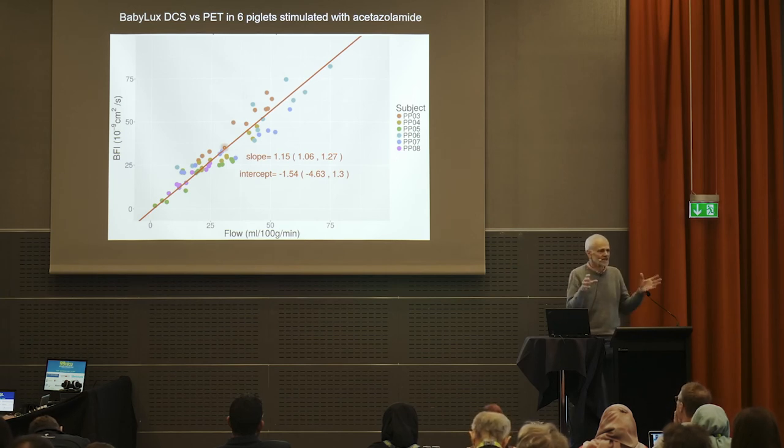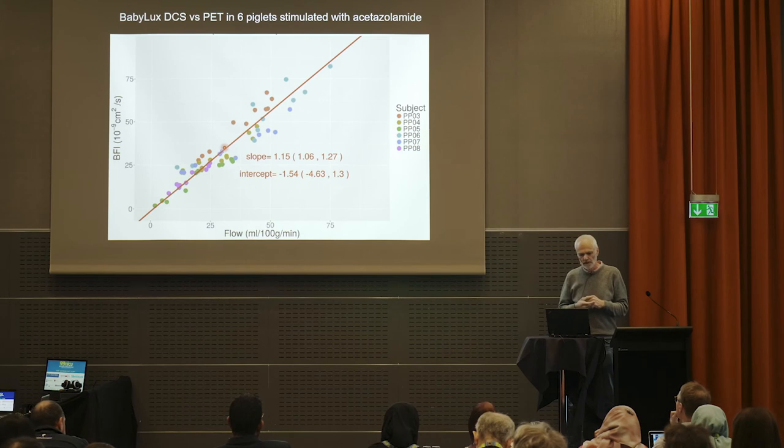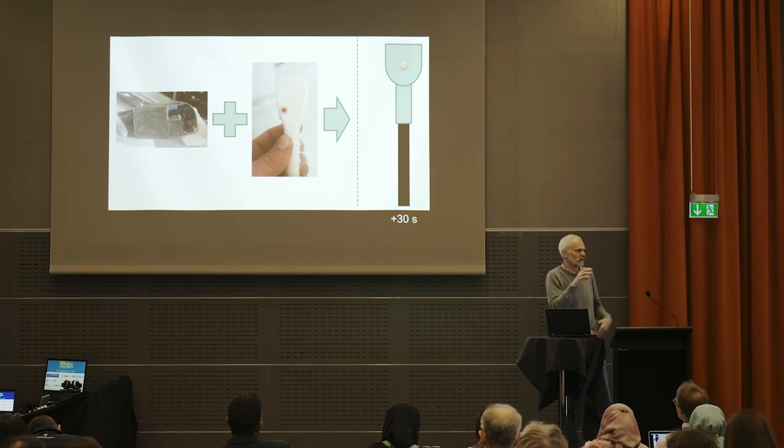And this is much better than the Xenon, where we use separate injections and you record over some time, because this is an almost instantaneous measurement. So that actually allows a monitoring of blood flow, and that would be very useful. The problem is that the whole machine is still pretty heavy, and it's going to be expensive also, and you can't imagine such an instrument at each bedside and each cot. So probably the most likely development of that instrument would be into some kind of a probe which you could move like an ultrasound machine, and then you could get a measurement of brain oxygenation and blood flow at any time you wanted.